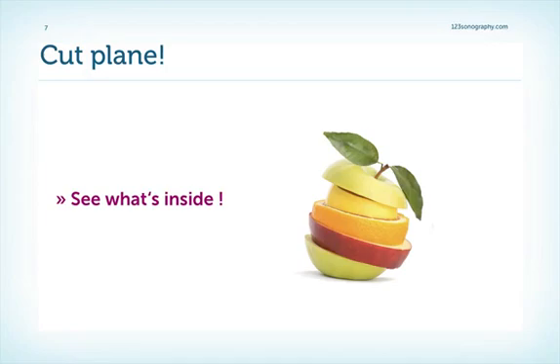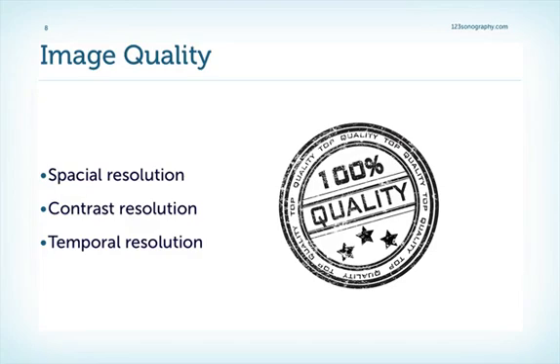The 2D image quality in echocardiography has made a tremendous leap in the last 2 or 3 decades. I can still remember the first images I saw was probably sometime around 1985 or 86, I guess. And at that time, I had the impression what people were doing with echocardiography was more like guessing. For example, at that time, I never really was able to really see the pulmonic valve. Now you can see it in every patient.